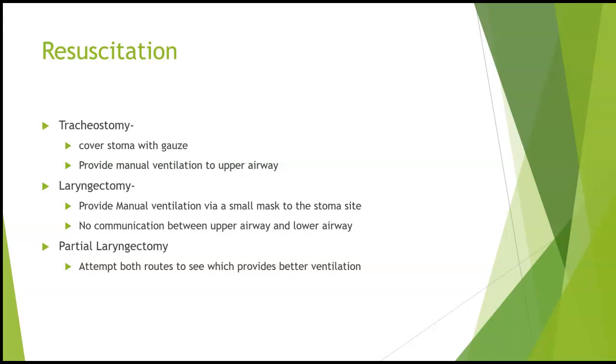So if you have to provide resuscitation to patients who have extubated themselves, or have removed or displaced their tracheostomy, your book does cover some special circumstances where it might not be obvious how you're supposed to manually ventilate the patient.